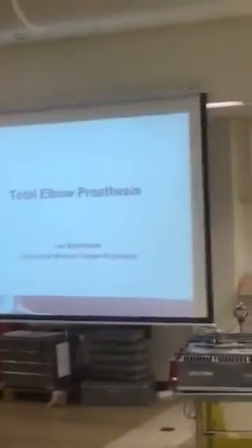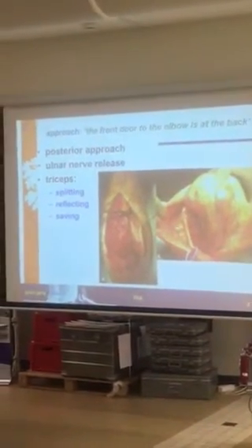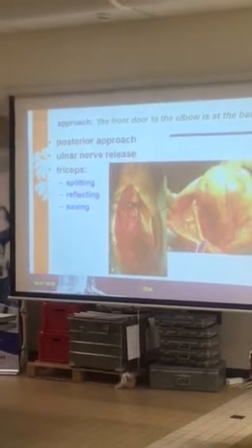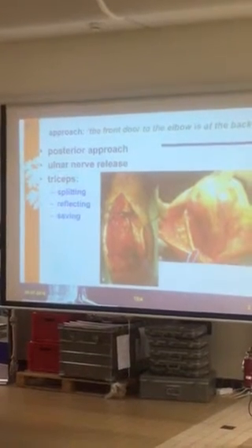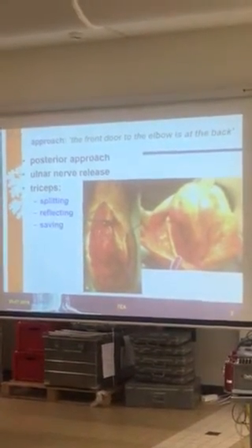About the reasons for prosthesis, because Dr. Yamaguchi has told us about it already. This is what O'Driscoll has taught us. The front door to the elbow is at the back, which means you need a posterior approach to do a proper total elbow. Which means you have to do something with the ulnar nerve. Otherwise you just leave it there but know all the time where it is.